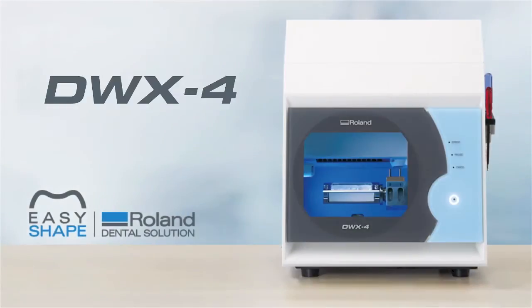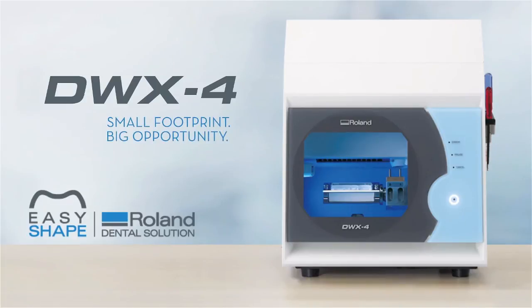Best of all, the DWX4 is backed by Roland Care support available in more than 133 countries worldwide. The DWX4 dental mill: small footprint, big opportunity.